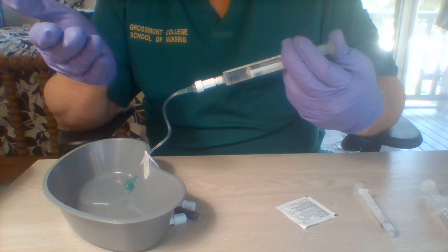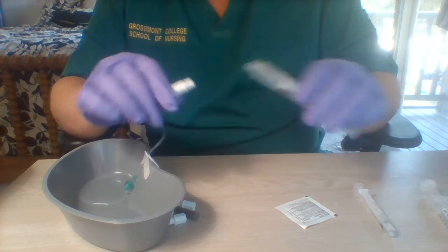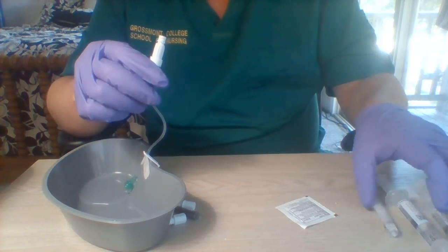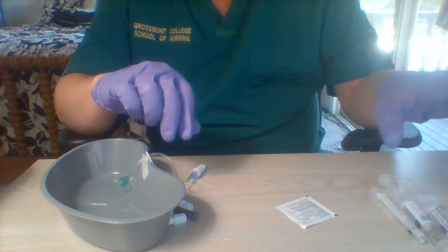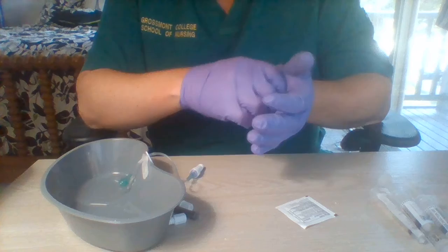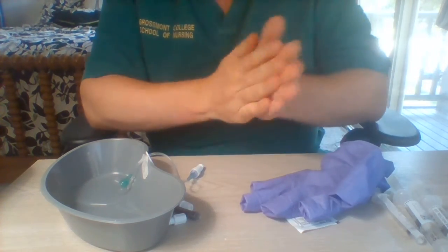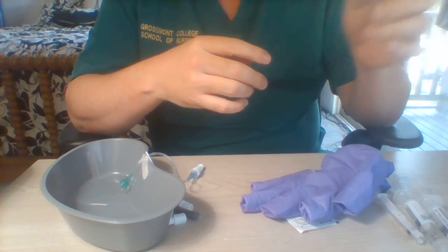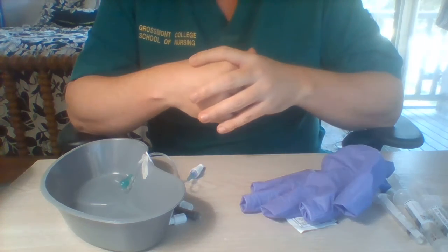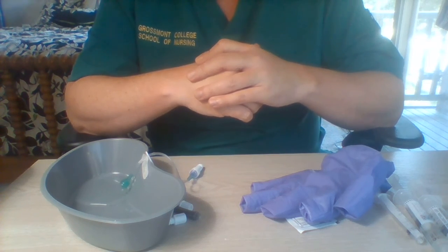All right, so we did 5 mLs. We'll detach that. I will discard the syringes in the sharps container, remove my gloves, perform hand hygiene, and document the administration of the drug. I also need to continue with the infusion and check back on the patient and make sure to check for medication effectiveness within the appropriate time.